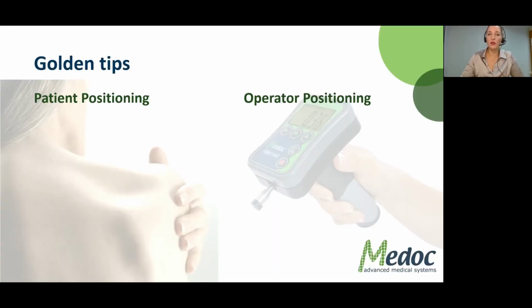Some golden tips. So again, about patient positioning. As with all QST, I want the patient to be comfortable. Have a comfortable chair for the patient. I need the patient to be concentrated on the stimulus that you're giving them, and not on the fact that because they're not comfortable, their lower back is hurting, or their hip is hurting, or they're moving in their seat. I want them to be as comfortable as possible, because otherwise they cannot be concentrated on the lab stimulus that we're giving them. They are feeling something else uncomfortable in their body.